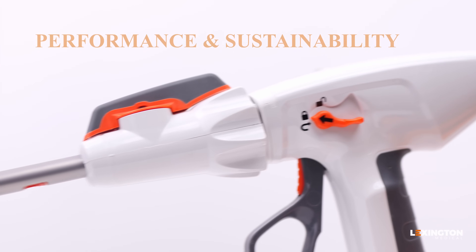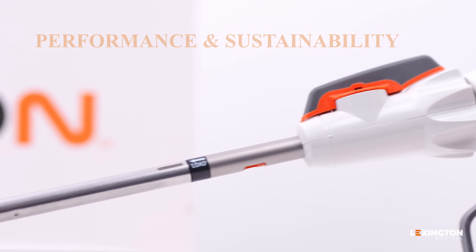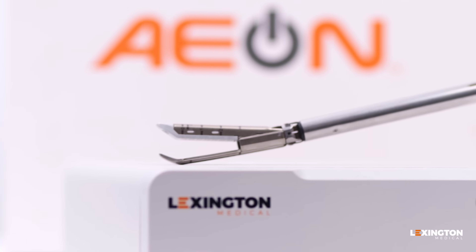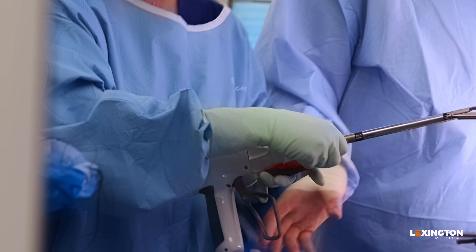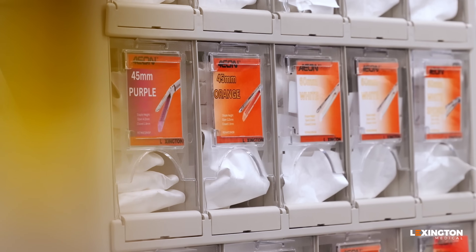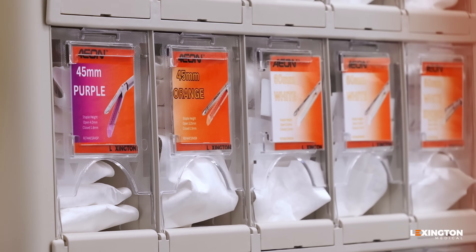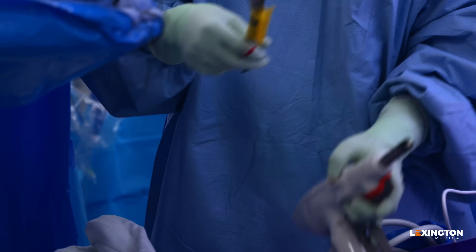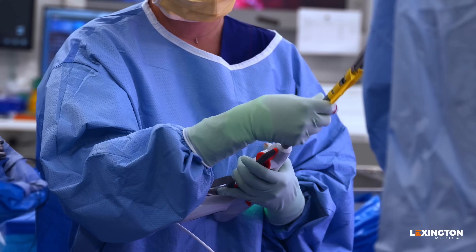Aeon is designed with both performance and sustainability in mind. By eliminating lithium-ion batteries, it reduces environmental impact while being lighter and easier to handle than leading competitors — an advantage in longer surgeries. The powered Aeon stapler positions Lexington to further build on the growing evidence of its superior staple lines, improving hemostasis and reducing complications.